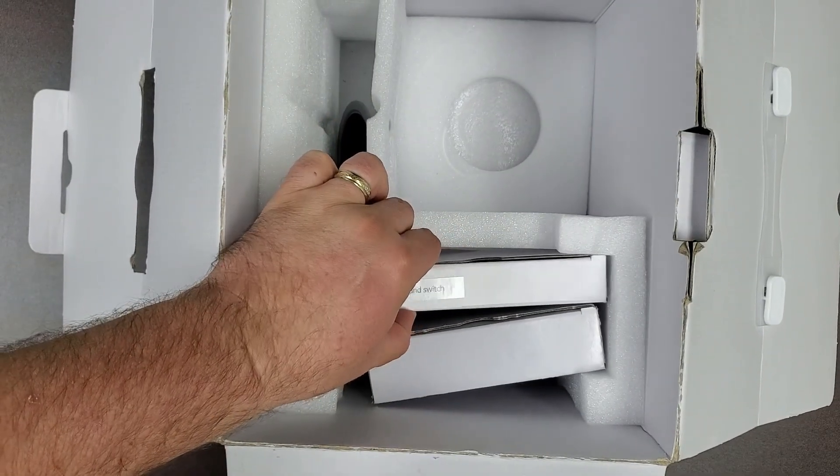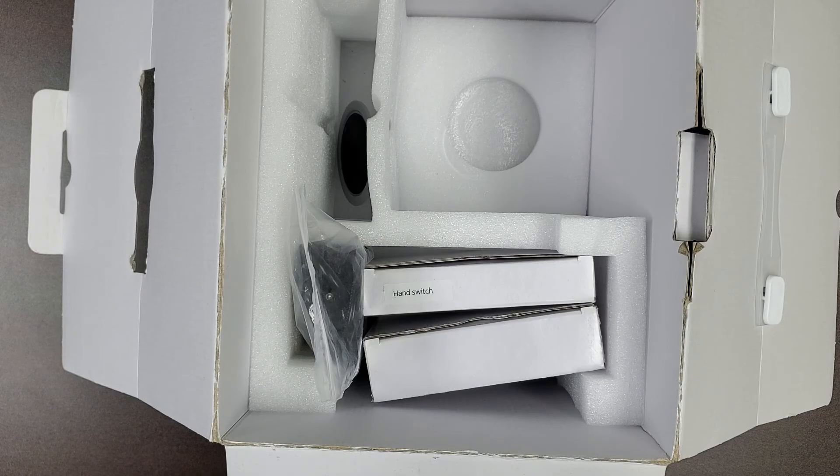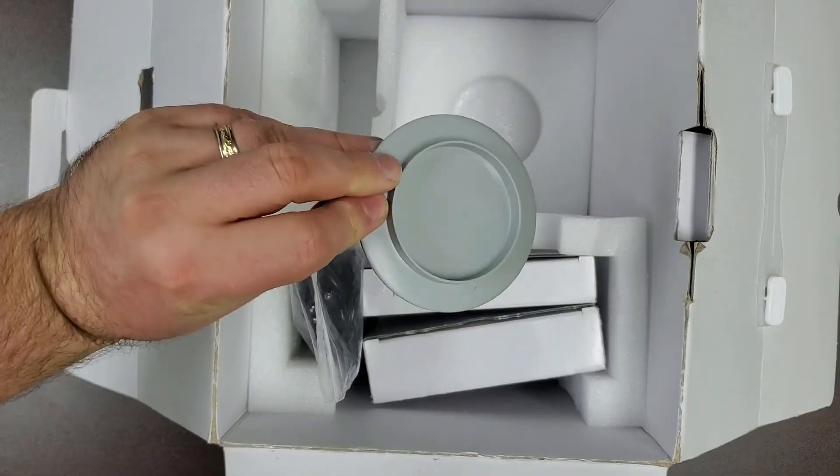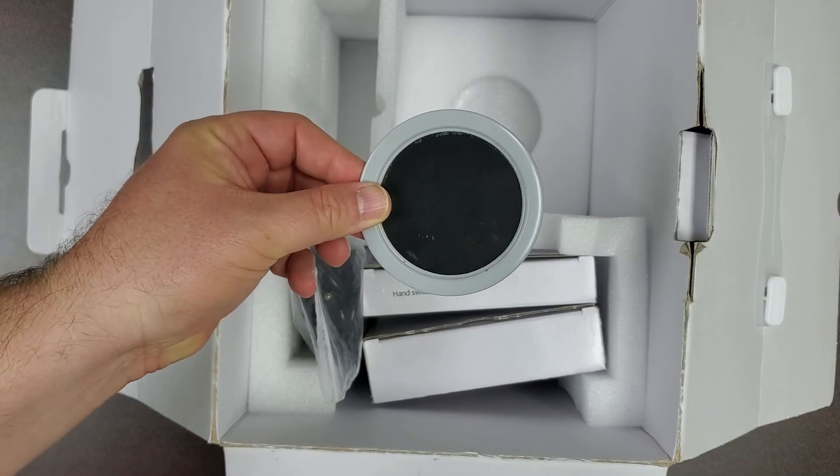The hand switch can attach to the side of the generator to distance the user from the X-ray source. Finally, you will find the FFC jig in the bottom of this section. This is used to calibrate the port view sensor to the Vetport X4.